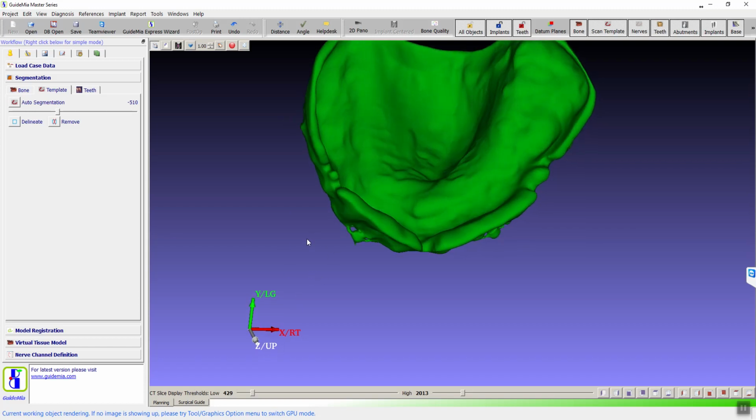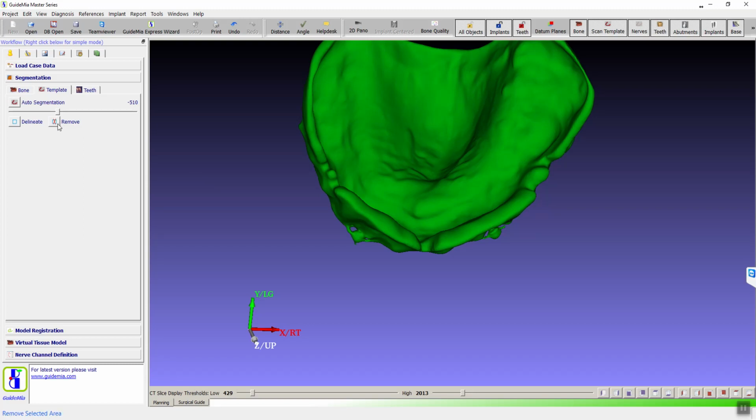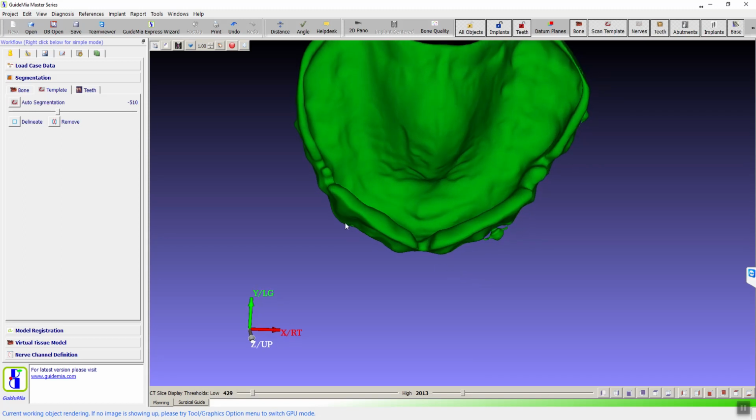In a regular situation, you probably don't need to do so, but for this case, with the SureMarkers, we don't really like this. I would just go with gutta-percha markers. Yeah, SureMarkers are a little more work for the clinician.